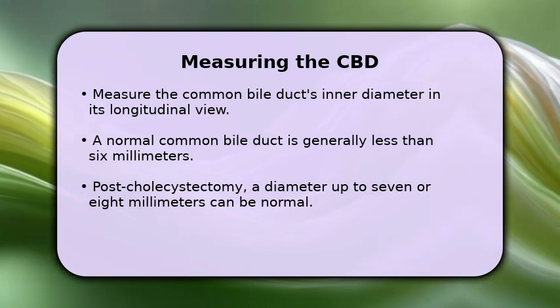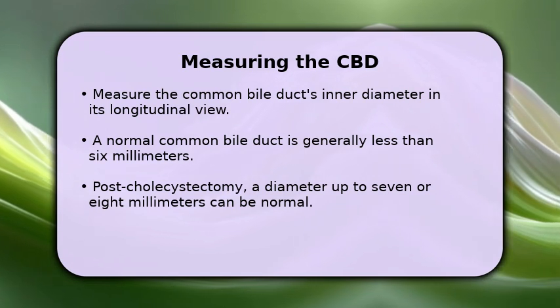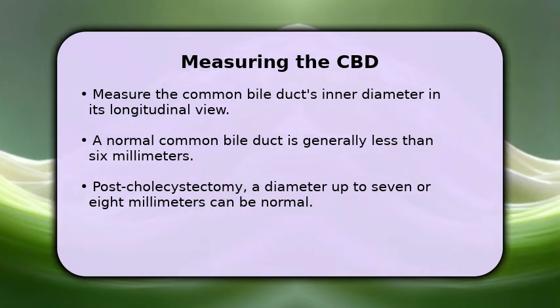However, in patients who have had their gallbladder removed, a diameter up to 7 or even 8 millimeters can still be considered within the normal range. Remember, accurate measurement is vital for assessing potential dilation.